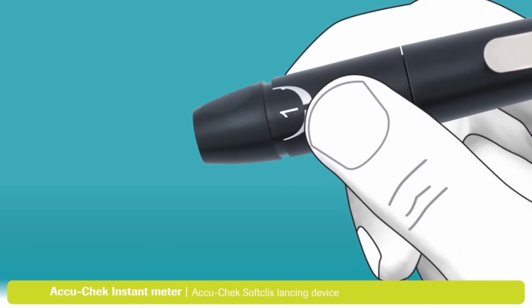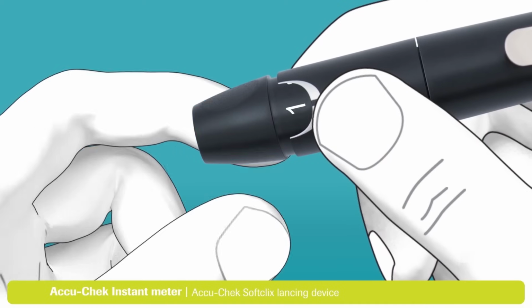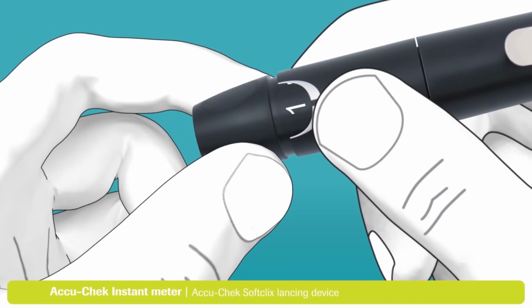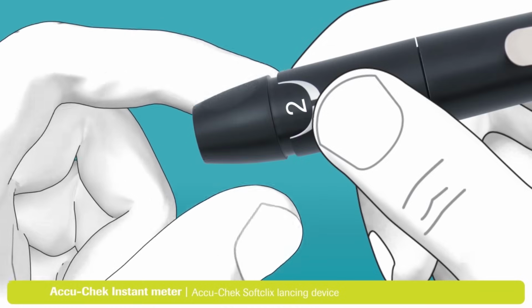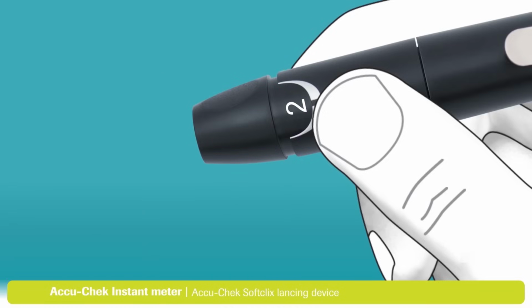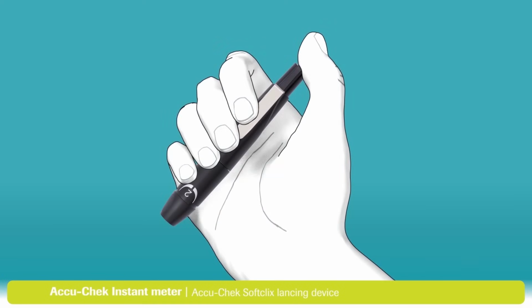Next step is to set the penetration depth to match your individual skin type. By turning the dial on the cap, you can select the depth of the lancet. Set the dial to 2 to begin with. You may need to adjust the setting a couple of times until you find the right level for your skin type.